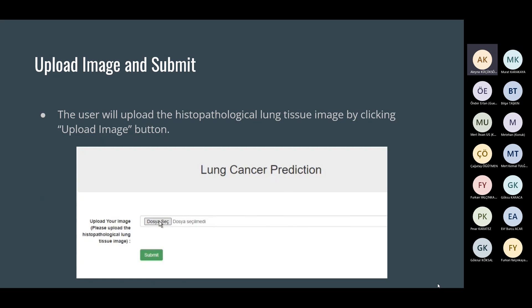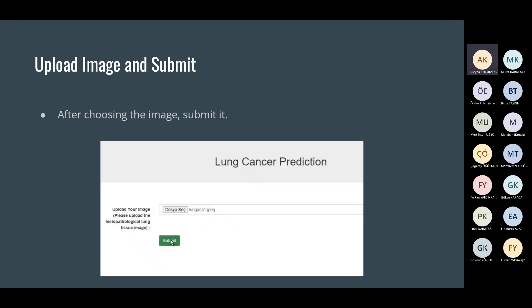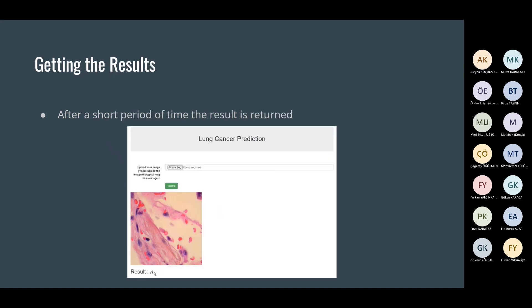Upload image and submit. The user will upload the histopathological lung tissue image by clicking the upload image button. In the next dialog window, the user is expected to choose a lung tissue image from their folders. After choosing the image and submitting, after a short period of time, almost six or seven seconds, the result is returned.